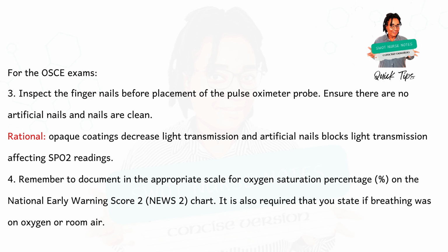Inspect the fingernails before placement of the pulse oximeter probe. Ensure there are no artificial nails and nails are clean. Why? Opaque coatings decrease light transmission and artificial nails block light transmission, affecting SpO2 readings.